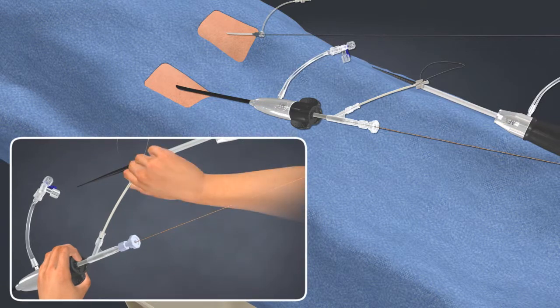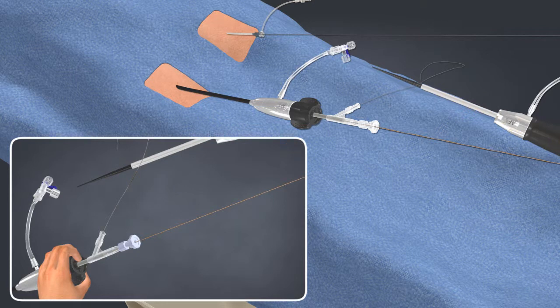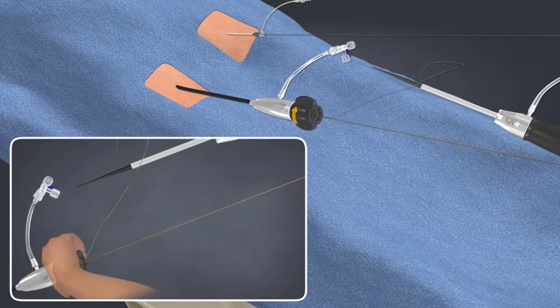Keeping tension on the wire from the contralateral side, peel away the contralateral limb wire from the dilator and remove the dilator. Upon removal, tighten the hemostasis valve.